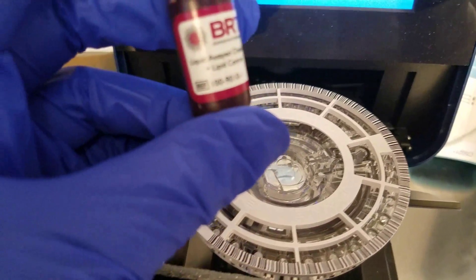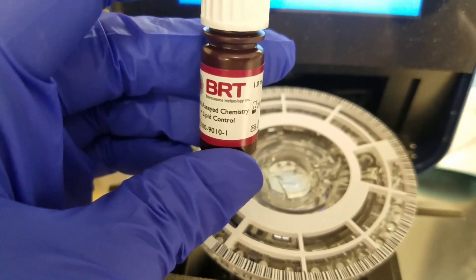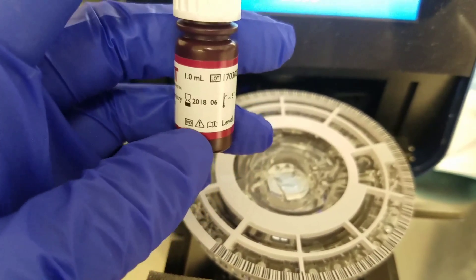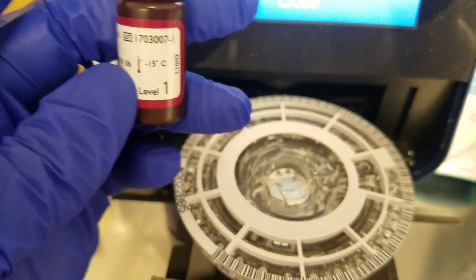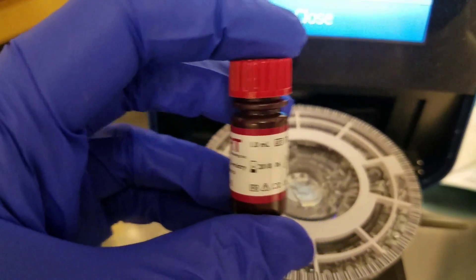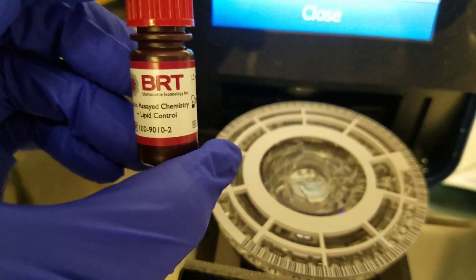We're going to add a tip on, and we are going to add our either patient or QC. Now, I'm going to do QC. Here's what the QC looks like. It's BRT liquid assay chemistry and lipid control, but we don't do lipids. Here's the level one — it's kind of in the brown and has a white cap — and then the red cap is this level two, or your high control.